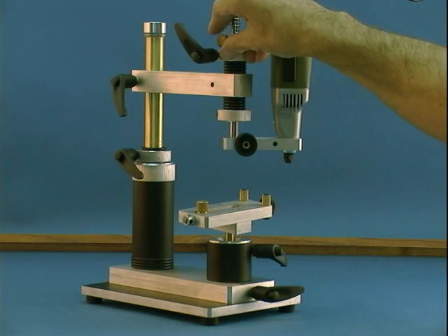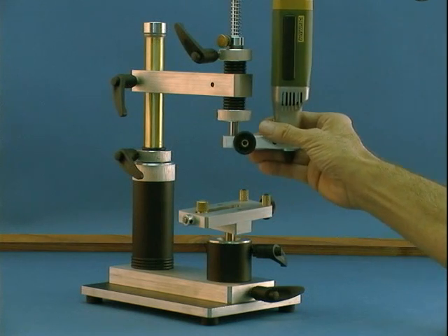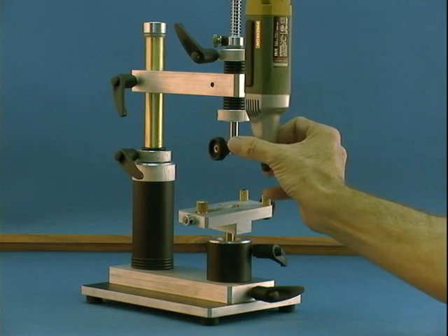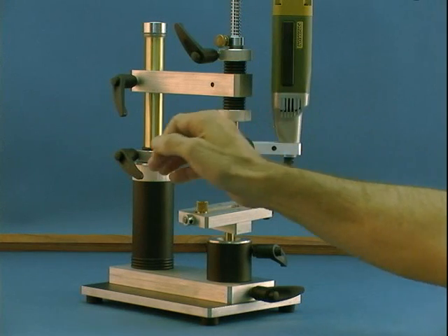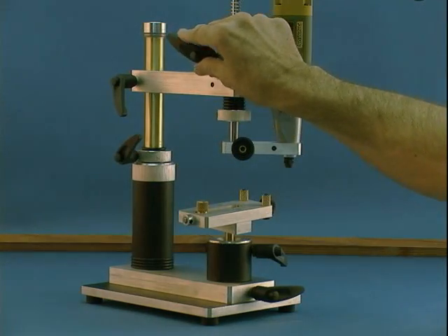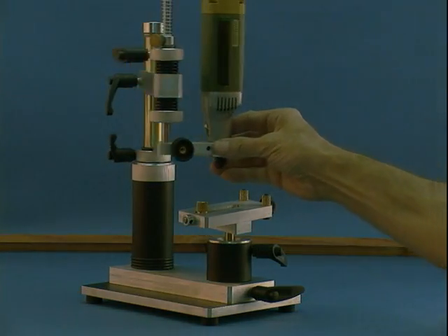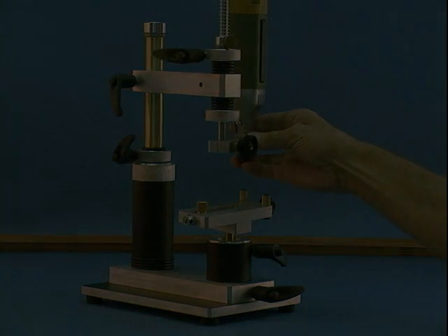Now we'll show you something even more unique. Modules that were part of the original MX-5 can be used on current MX series. That would make the MX series forward compatible.